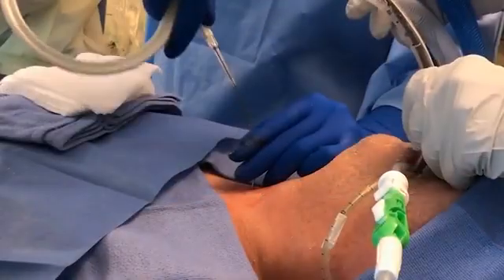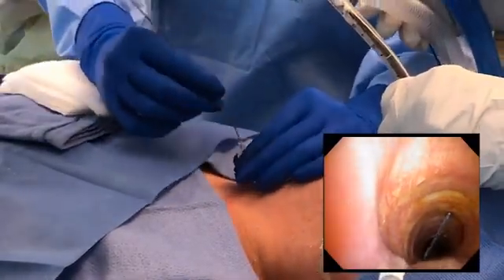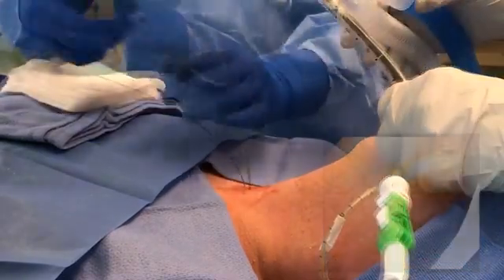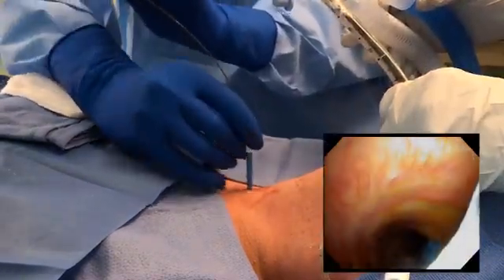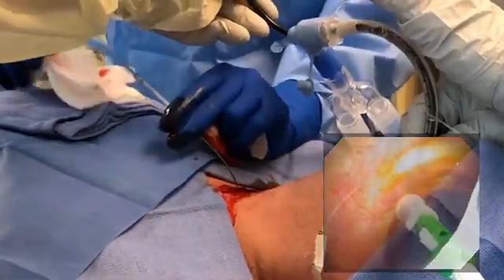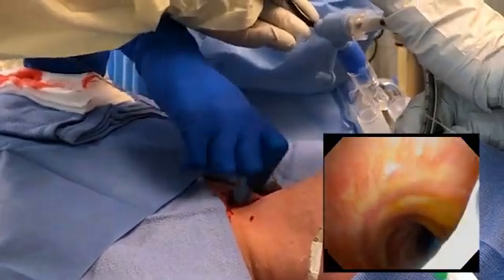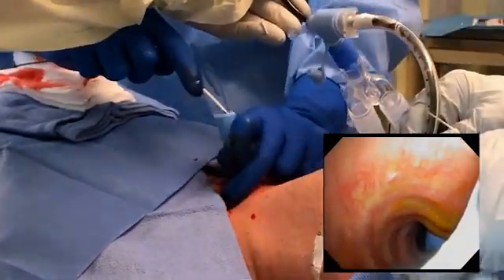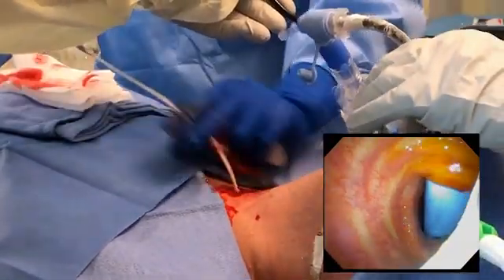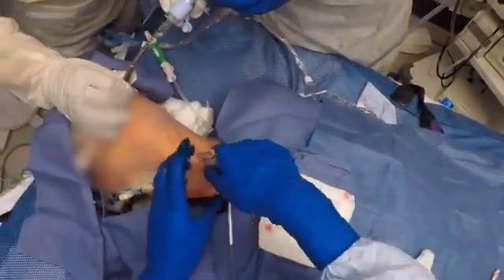tube. Feed the guide wire through the needle and visualize it while advancing it distally toward the carina. Remove the needle over the wire, keeping the wire in the trachea at all times. Advance the small tracheal dilator over the wire to dilate the tract. Remove the small tracheal dilator and advance the single-stage progressive dilator over the wire with the protective sheath loaded. Remove the progressive dilator, keeping the wire and protective sheath in place.